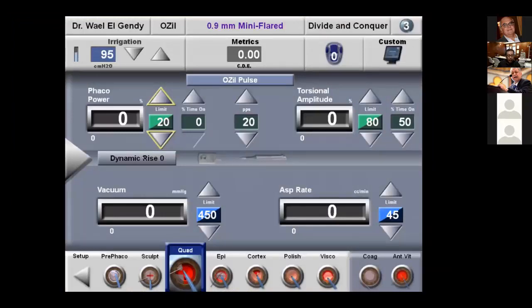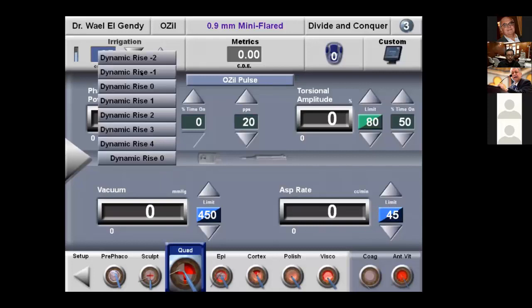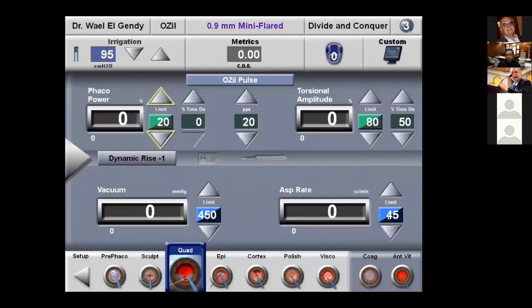This is the dynamic rise. When the dynamic rise is zero, it means that your aspiration rate is whatever you have here. But when I change it to minus one, it means that when my phaco tip is blocked by nuclear fragments, my aspiration rate will go down by 25%. If I change it to minus two, that means that my aspiration rate will go down by 50%, which will take me to almost 22, okay?